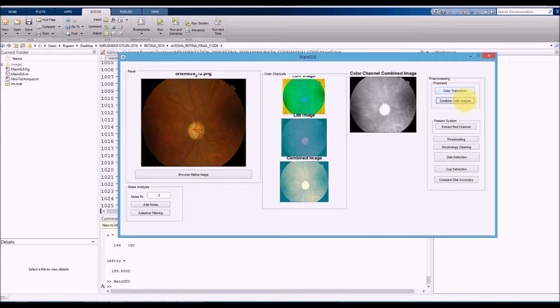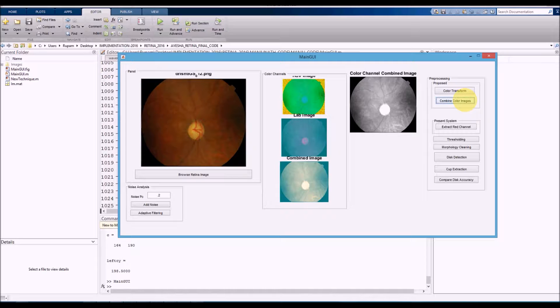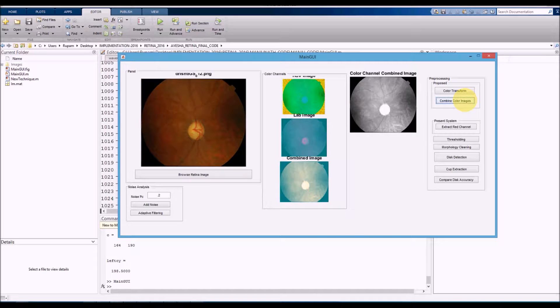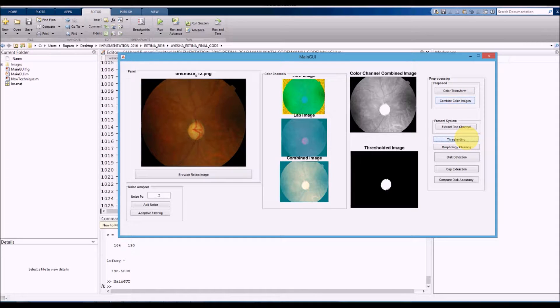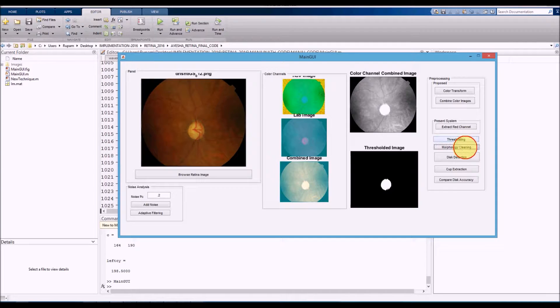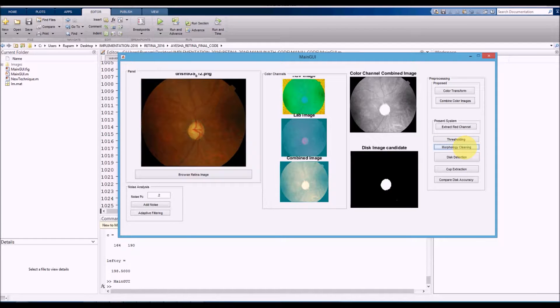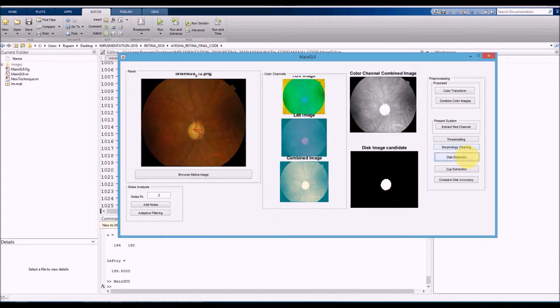We combine the color images and convert it into grayscale. Now the disk area is very clearly masked. We perform thresholding. This part is the present system, but we're going to move with our proposed system. We perform thresholding followed by morphological cleaning, followed by disk detection.